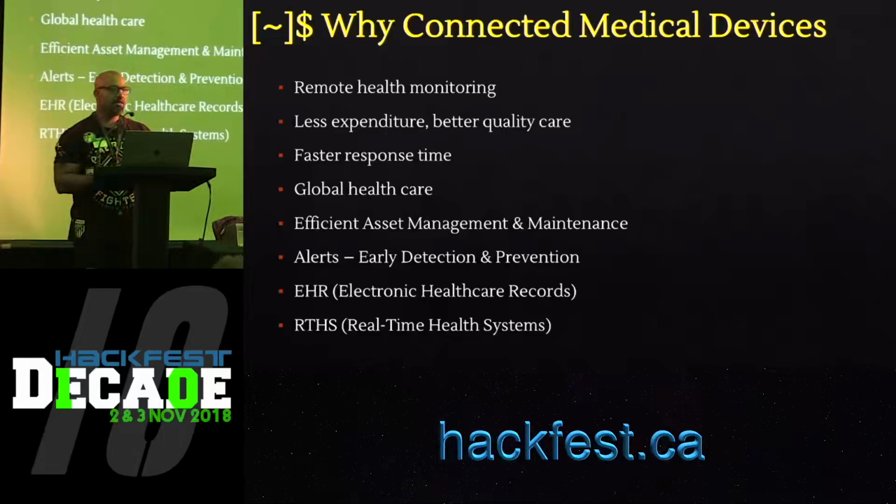Once it was connected to the infusion pump, there was an option to export the network configurations through IRDA onto the PDA device. So we were really excited. We were like, yeah, this option is pretty cool, because we needed it to connect to a wireless network. So that's the route we tried.